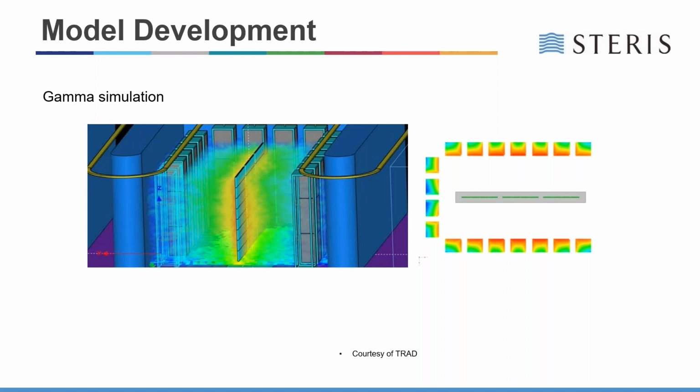And from this, you can infer that the accumulated dose would be the summation of all of these parts. It's worth noting that there are some significant differences between the center points, between the edges, and especially between the points along the left-hand side. I'll use my cursor now, we can see the points along the left-hand side and the center points and the edges. And here we come to a question about simulation from the standpoint of computational capacity, which is benefited from being able to accumulate the dose from all these individual substeps. And this would be what we would call a dynamic representation of simulation, something where we're reproducing the actual motion that a product or a carrier takes within an irradiator.